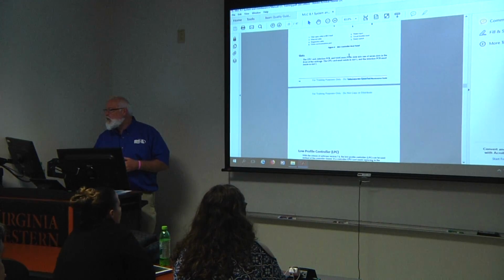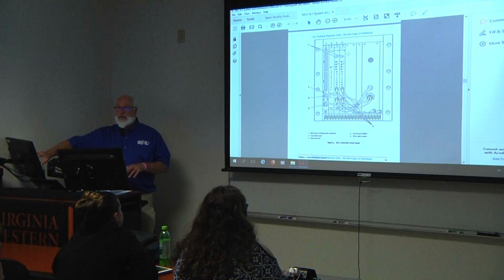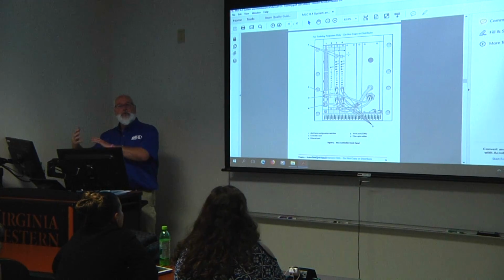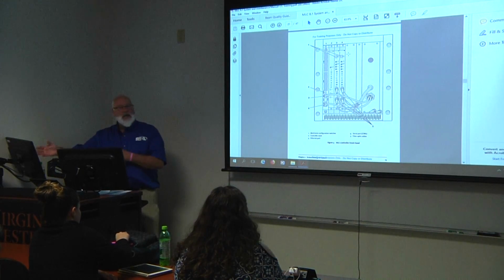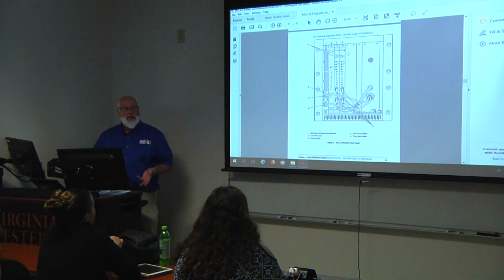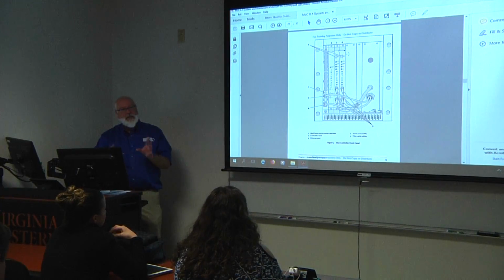Also on this one, there are some lights. Those need to be on and in a certain sequence to tell you that the system is functioning properly. Now, I wouldn't expect you to know what the lights mean, but I might ask you, hey, can you go look at your MOTCOM board? You have two of them. Do you have a green light on it? Do you have a yellow light? Do you have any red lights that are showing?